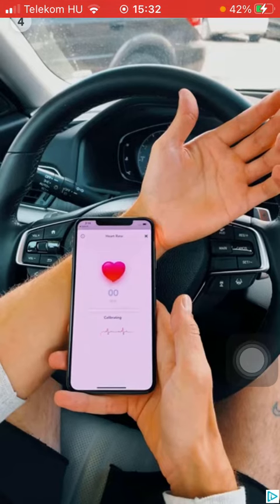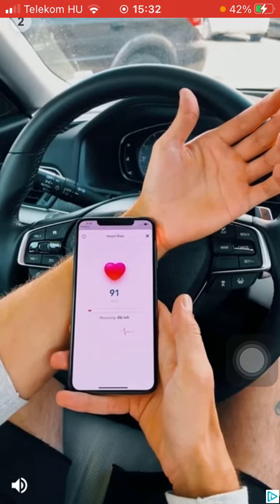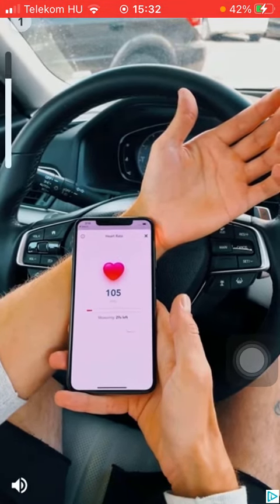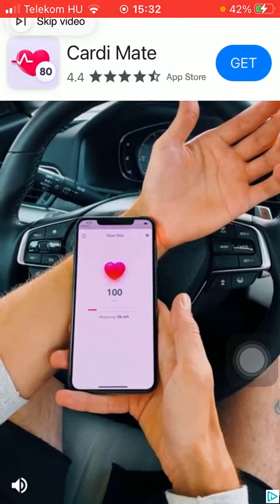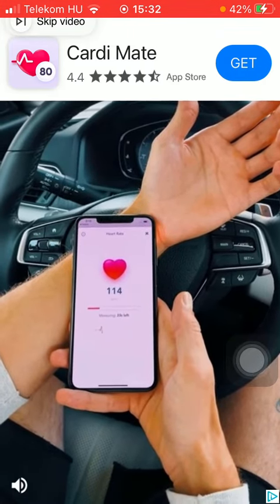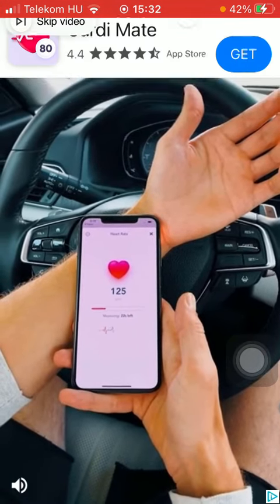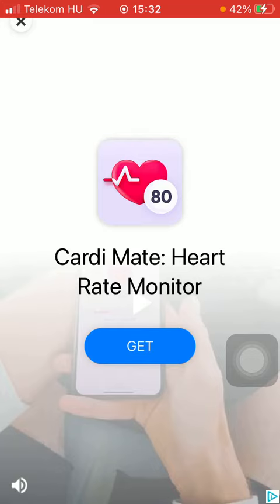First of all, open the application on your device, then press the Start button down below. Then tap on the icon at the upper left corner of the screen.